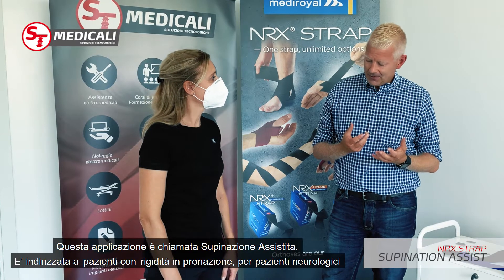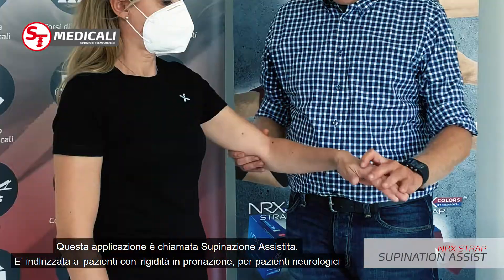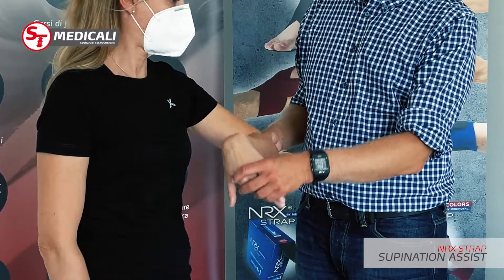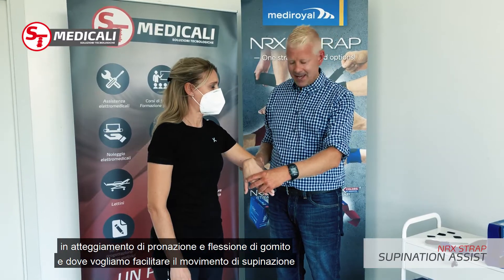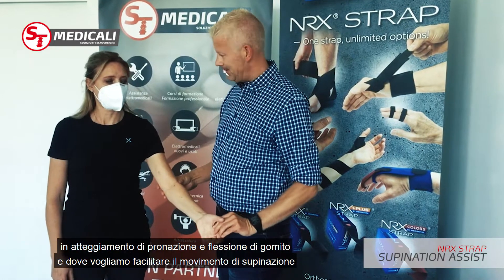The next application is a supination assist, which is basically for patients with forced pronation. This could be neurological patients who have a pronation pattern and we need to be able to facilitate supination of the patient.